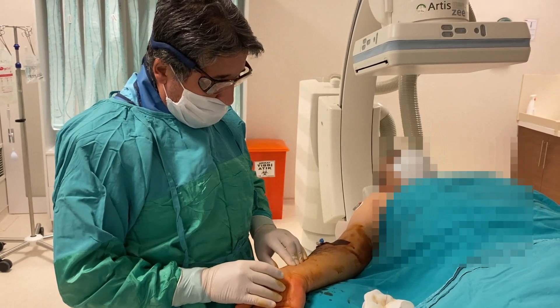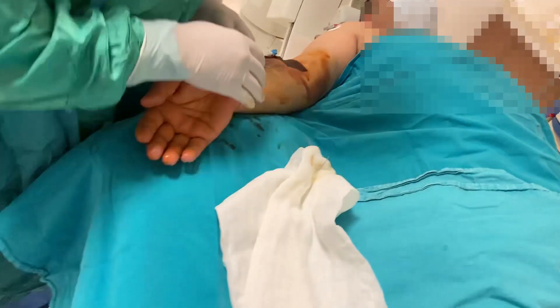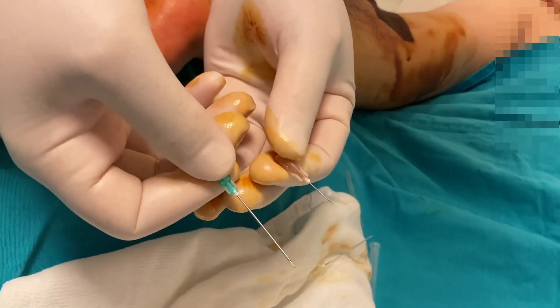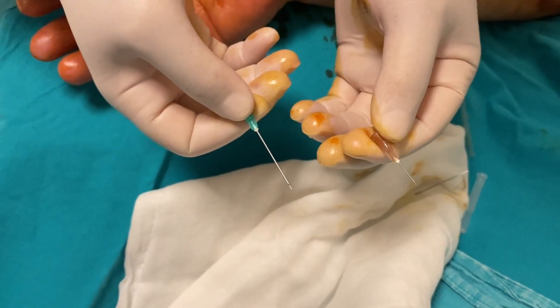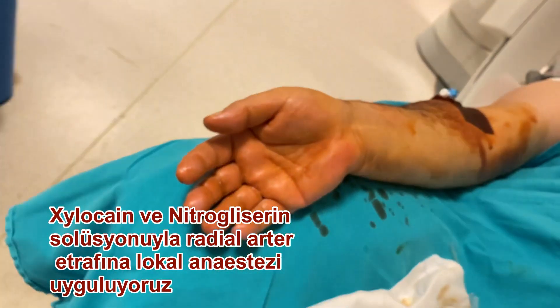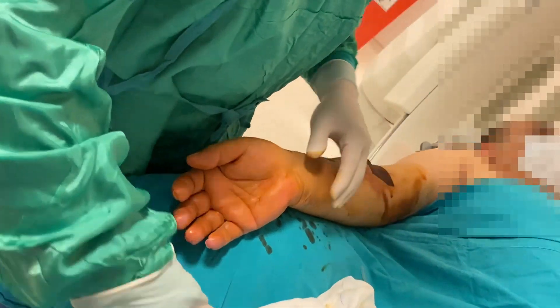Atar damarı elimizin altında palpe ediyoruz. Buraya girebilmemiz lazım; buraya ince uçlu bir iğne ile, insülin enjektör ucu ile uyuşturma yapıyoruz. Bakın, şu normal iğne yapılan uç. Şu da bizim uyuşturmak için kullandığımız insülin enjektör iğne ucu. Dolayısıyla acısı çok az oluyor. Bunu enjektörümüze takıp bu bölgeyi uyuşturuyoruz; sizden önce biz uyuşturduk burayı.